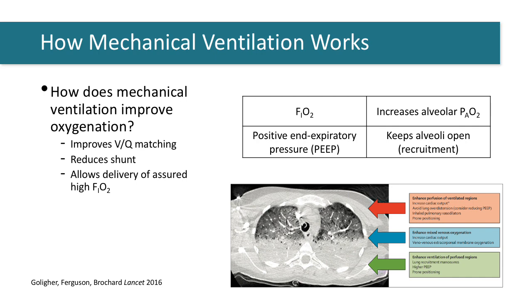So the other way in which the ventilator can improve oxygenation is by applying positive end expiratory pressure to minimize the amount of lung collapse. This is called lung recruitment. And the goal of setting positive end expiratory pressure is to minimize lung collapse in order to minimize shunt and improve oxygenation of blood.